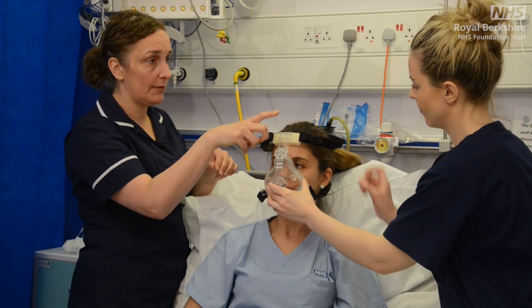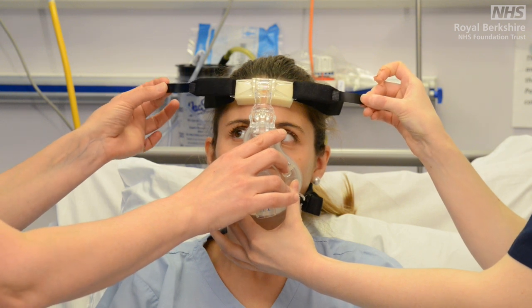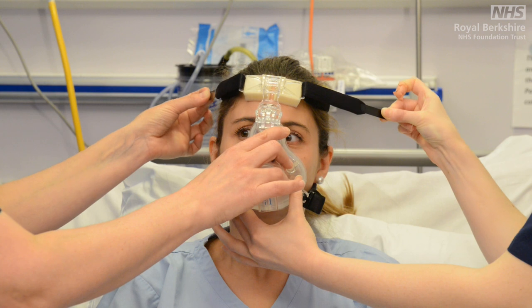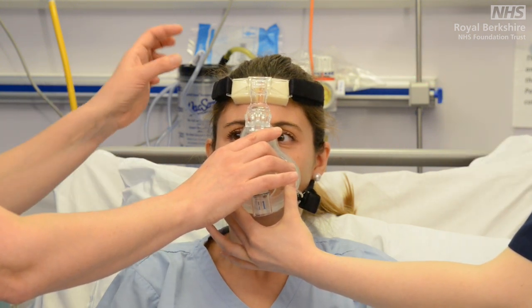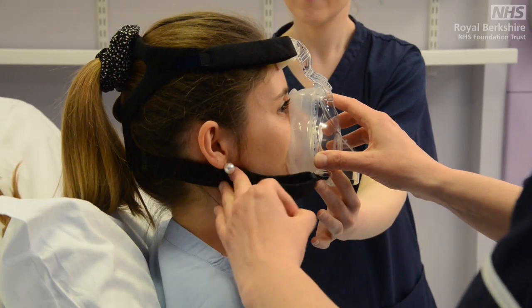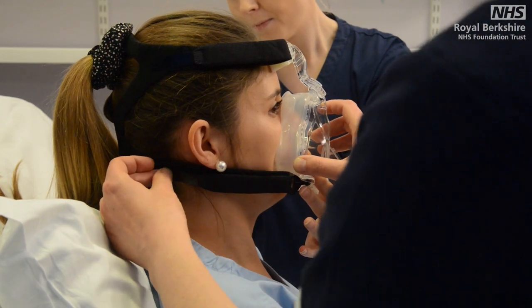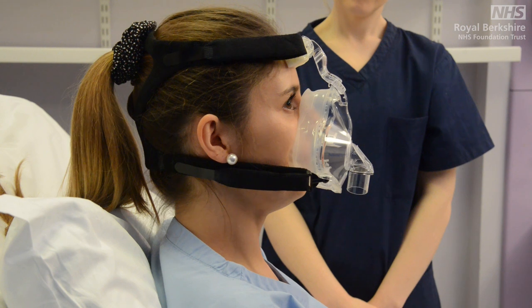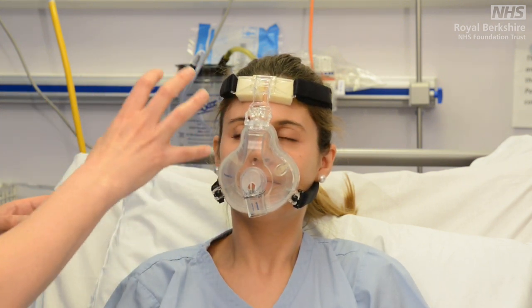We're going to start with the top straps. Release the Velcro on each side simultaneously — I have about two inches of strap here. Pull at the same time, so about three inches, and offer that up to the patient. You can do this in stages — stage one on the top straps, then come down to the bottom, and make small adjustments as you go. So doing the same on the bottom straps, I've got about an inch and a half to two inches; slowly tighten. What we're looking for is that I can still get a finger under the strap — we're not trying to pull this mask so tight that there's a seal; we're just ensuring the mask remains in position on the patient's face.